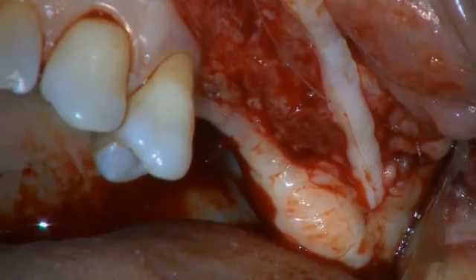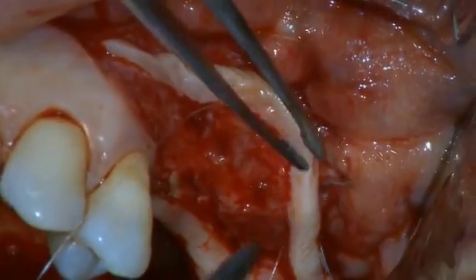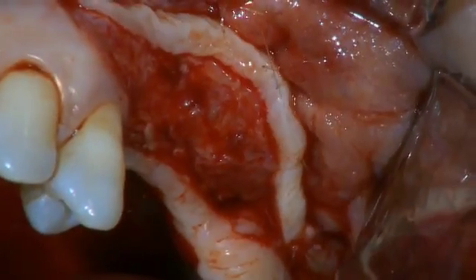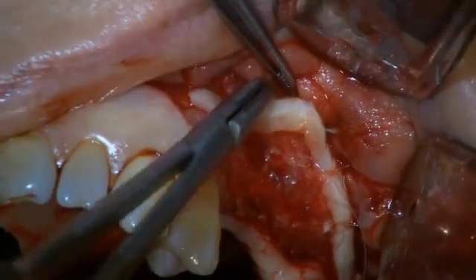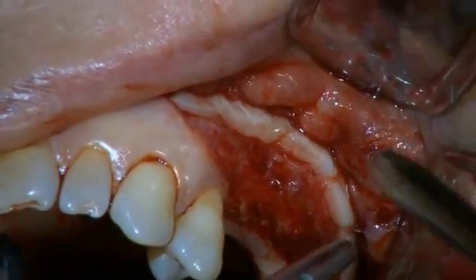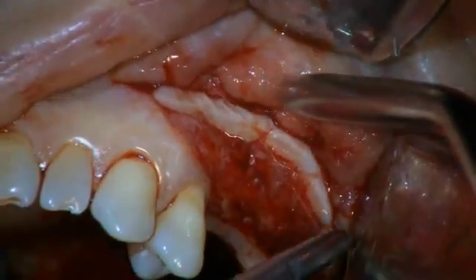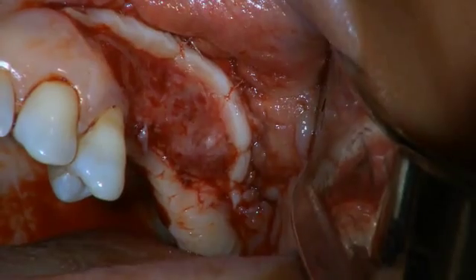The graft is then immediately sutured in place with 6.0 resorbable monofilament sutures. First on the distal end, then cross-mattress sutures are placed to fix and position the length of the strip, and a single suture is used to attach the mesial end of the graft. Here we see the strip graft fixed in its desired position.